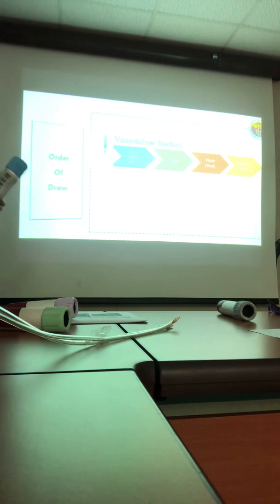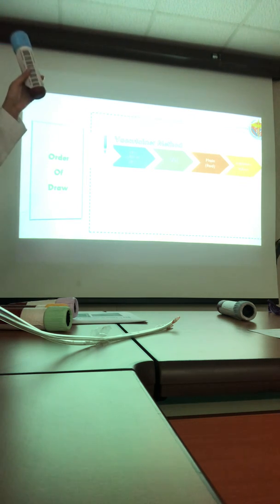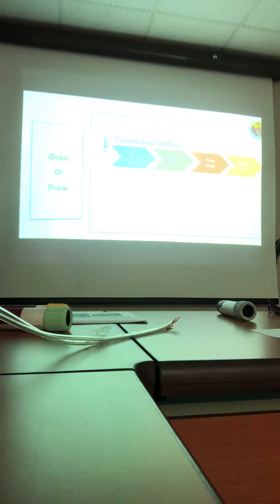The blue top tube is the only tube I should fill until the line. If it's underfilled or overfilled, the lab will reject the sample. Does somebody know why? Yes, we know. Why is this the only tube? The EDTA I should fill 4 ml, but if I send 2 ml, the lab will accept. Why do they reject the blue top tube if it's underfilled or overfilled? Because maybe it has additional blood.